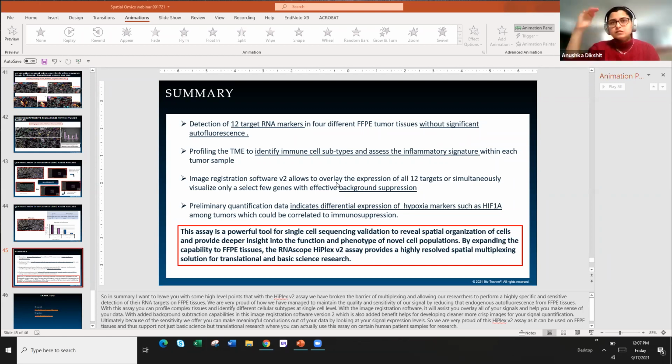They have a certain list of criteria that have to be met before the probes can be designed for the target. If there's high GC content or things like that, they have ways to work around that on the target sequence, given that it's long enough to meet all the parameters. So we try to keep everything very uniform for all of our target probes. So it's a delta function, there's no variability.